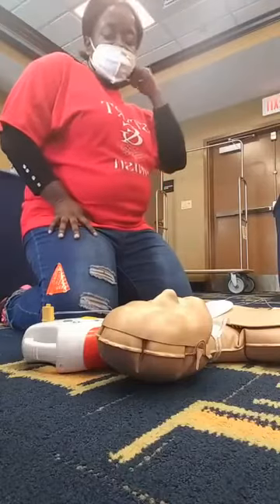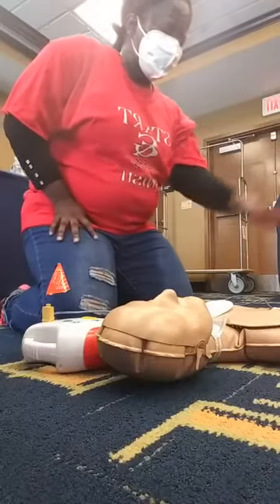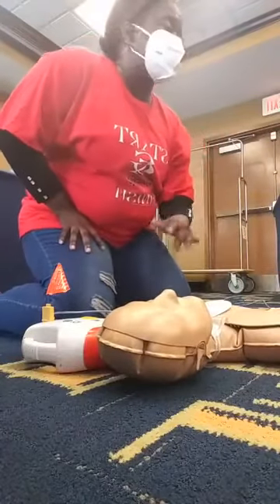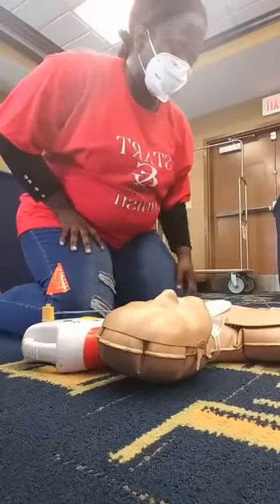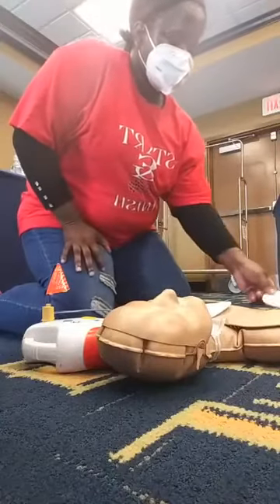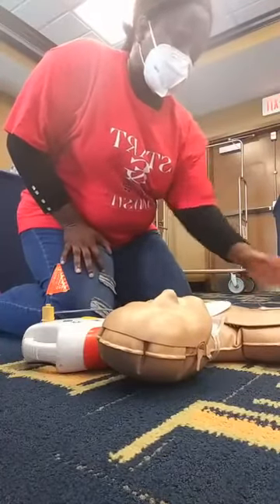Also, people with chest hair: if you place the pads on a hairy chest, the pads may stick and they may not stick. The AED will prompt you to press the pads firmly, but after you've done that a few times and it still doesn't work, you can just snatch the pad off and it'll remove the hair and you can replace the pads. Some AEDs may come with a razor. If it does, you can quickly shave the area and then place the pads.